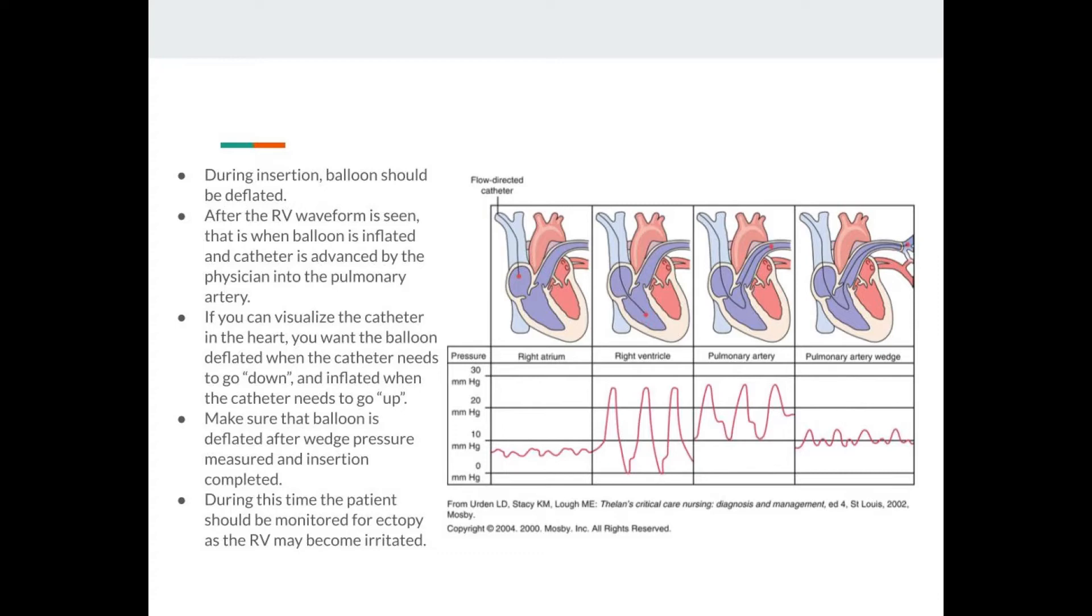So when you insert it, the balloon is deflated, it'll be going down into the right atrium into the right ventricle. After you see the RV waveform, typically that's when you should or you'll be told to inflate the balloon.